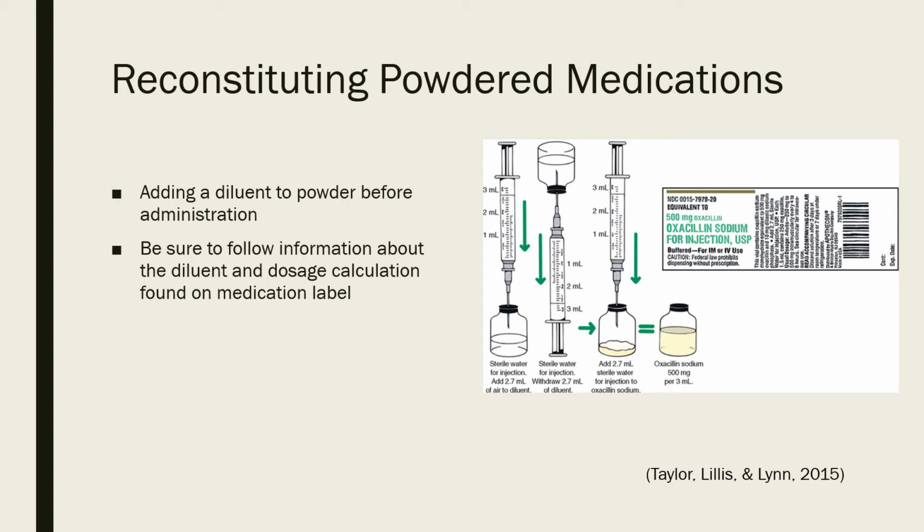And then you'll withdraw it like we just talked about, where you turn it over, keep the needle inside the solution, and withdraw the fluid out in the proper amount.